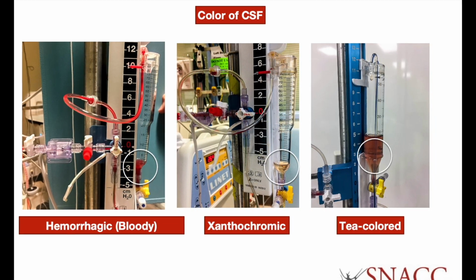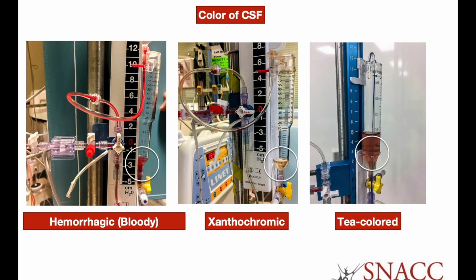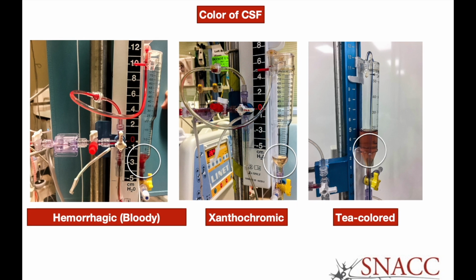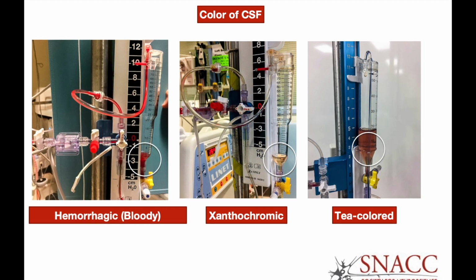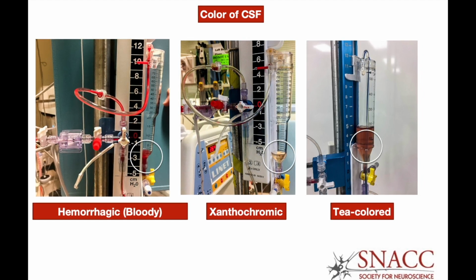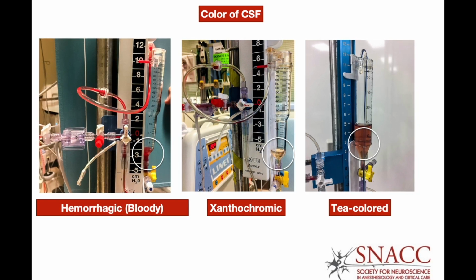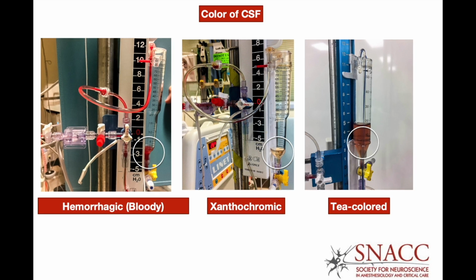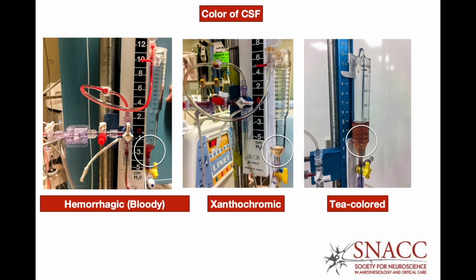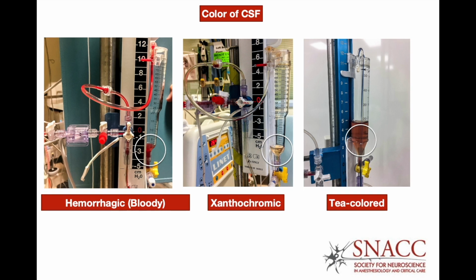The reason it's incredibly important to note this prior to taking the patient to angiography or the operating room is that acute changes in cerebrospinal fluid volume, output, and color can denote several things, such as re-rupture of an aneurysm intraoperatively, or extension or rebleeding from intraventricular or intraparenchymal hemorrhages. If you note any of these changes, it's incredibly important to let not only the anesthesia staff attending know, but also the neurosurgery team, as there may be an intervention that needs to take place in an expeditious fashion.